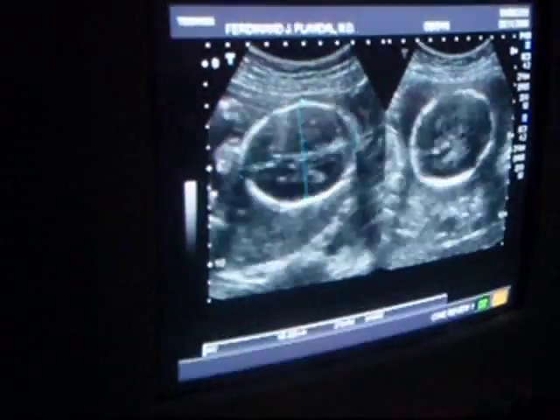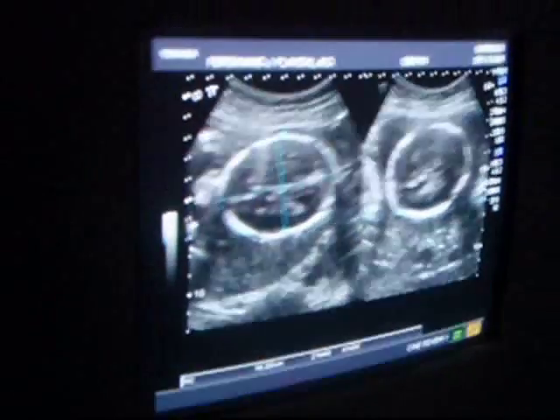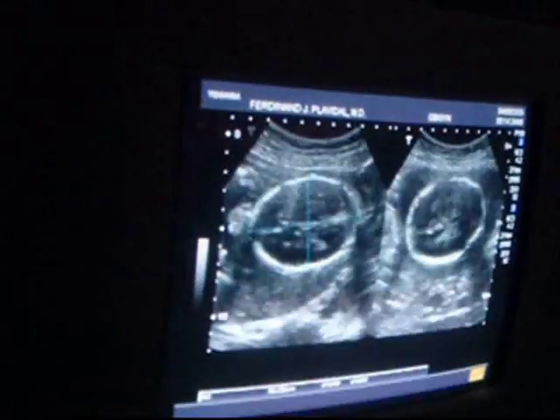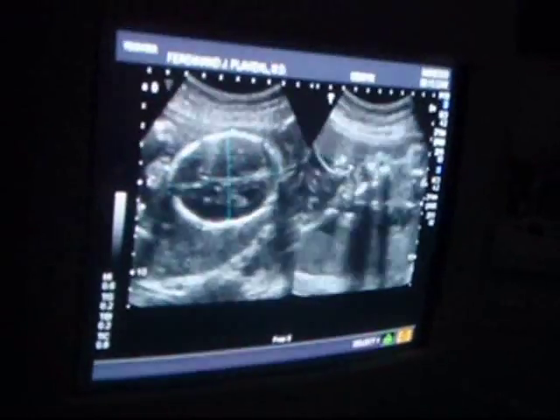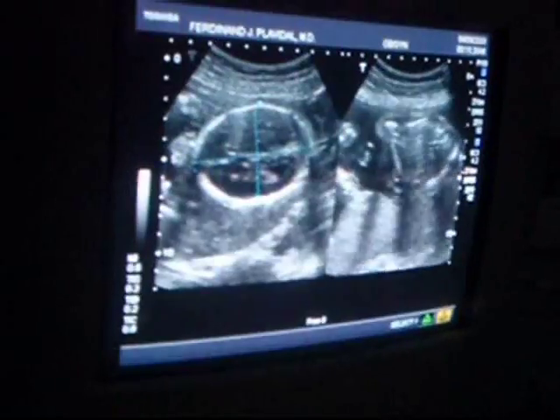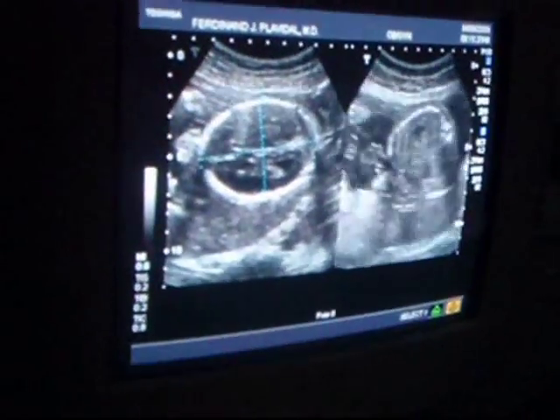Just so much more comfortable with this machine. Yeah, and it's terrible because the other machine is better, which is really not good news. You know, you're supposed to use the best machine on people. You're not supposed to use the inferior machine. But I have this puppy humming right now.